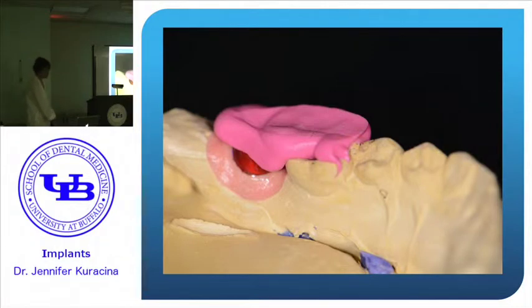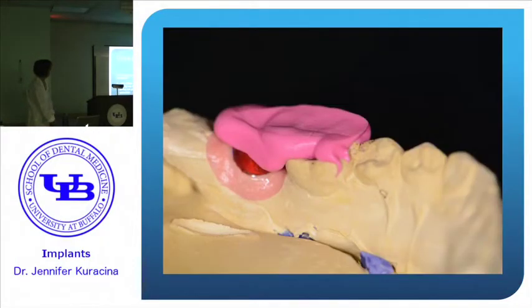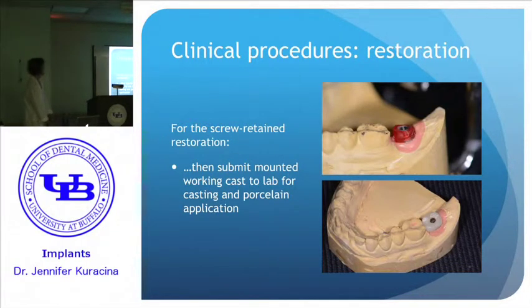Jennifer, some of those abutments are milled, scanned, right? You can't apply porcelain to them, though. These are cast too. I know, but I'm just saying, never mind, maybe I'll do it. So then you can send it off to the lab to be cast and have porcelain applied.